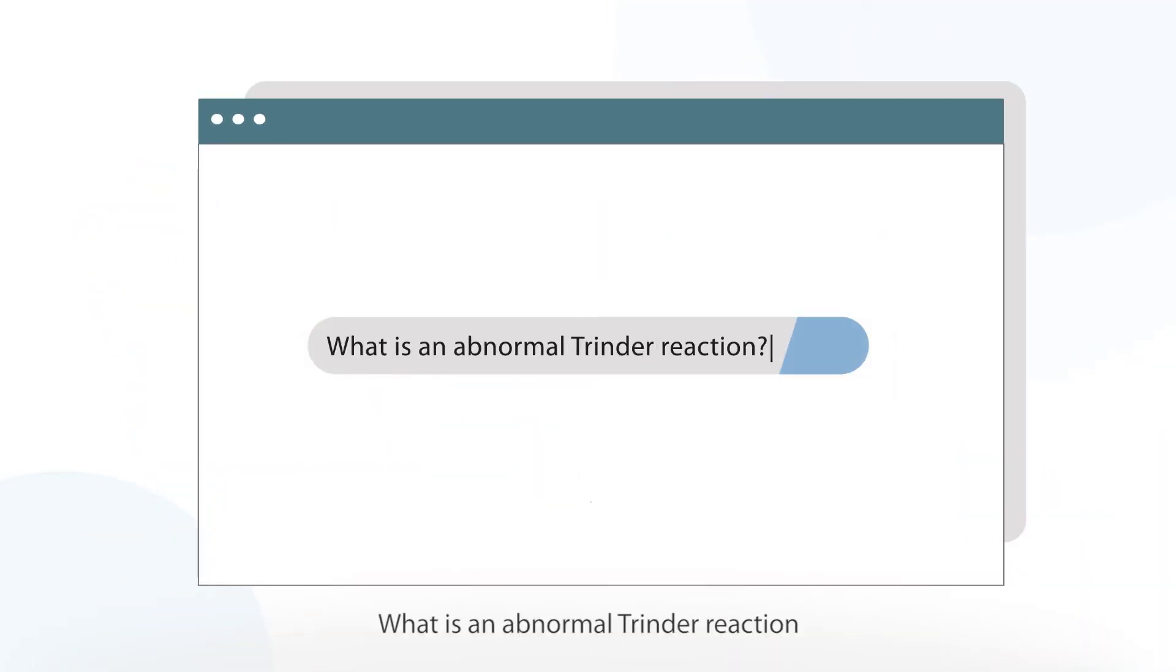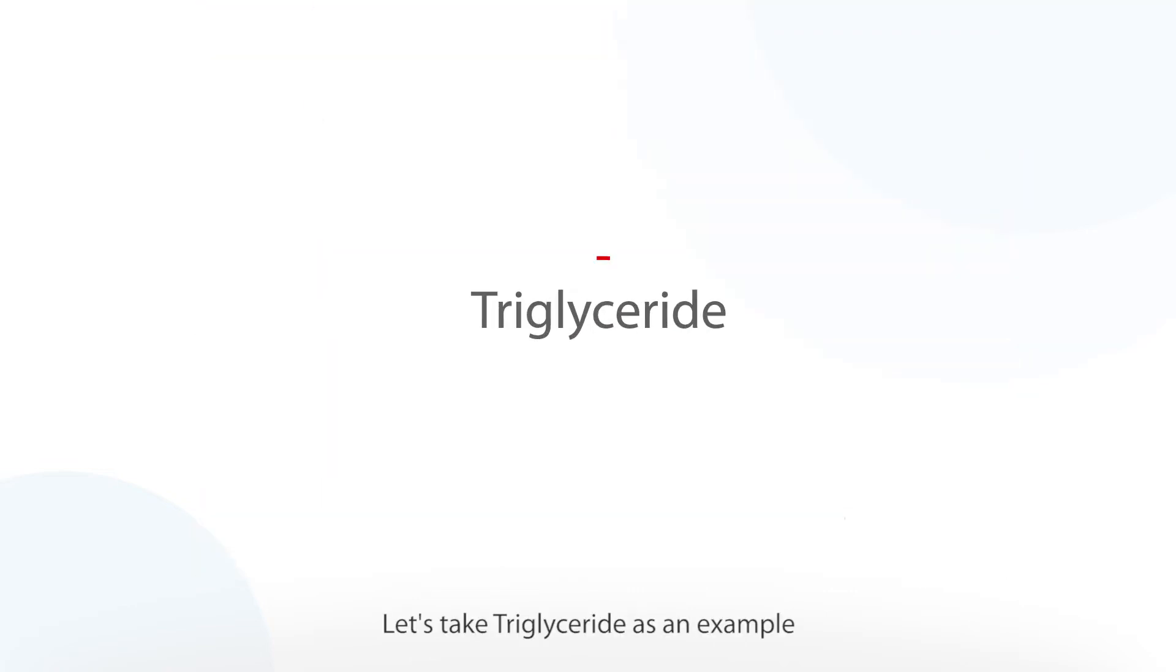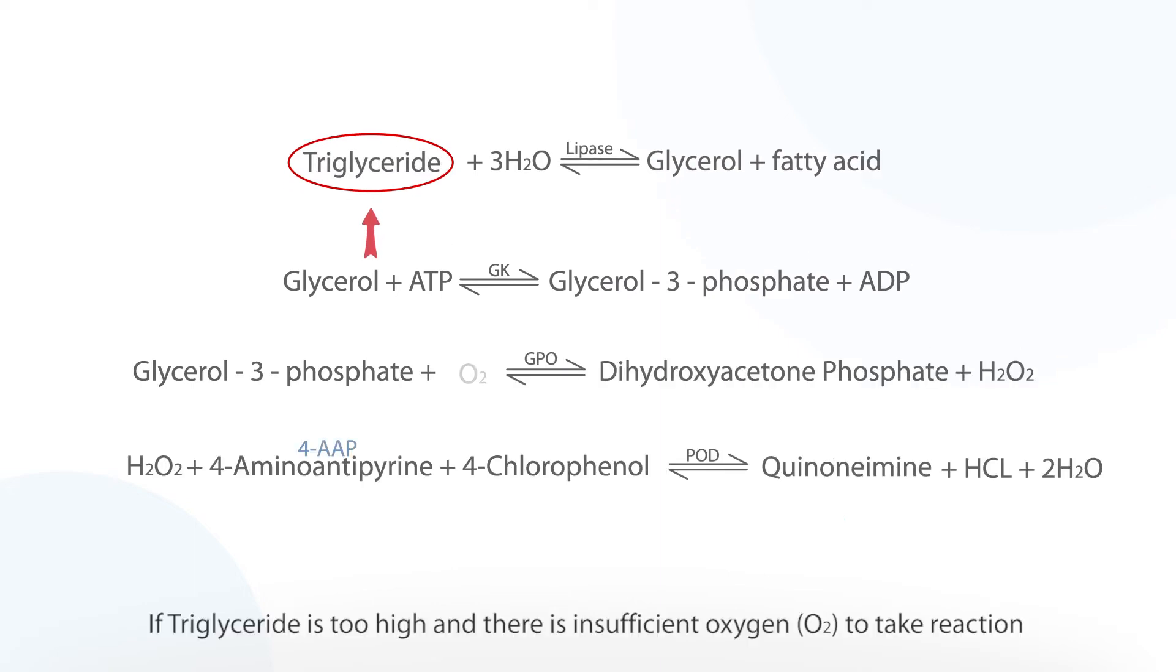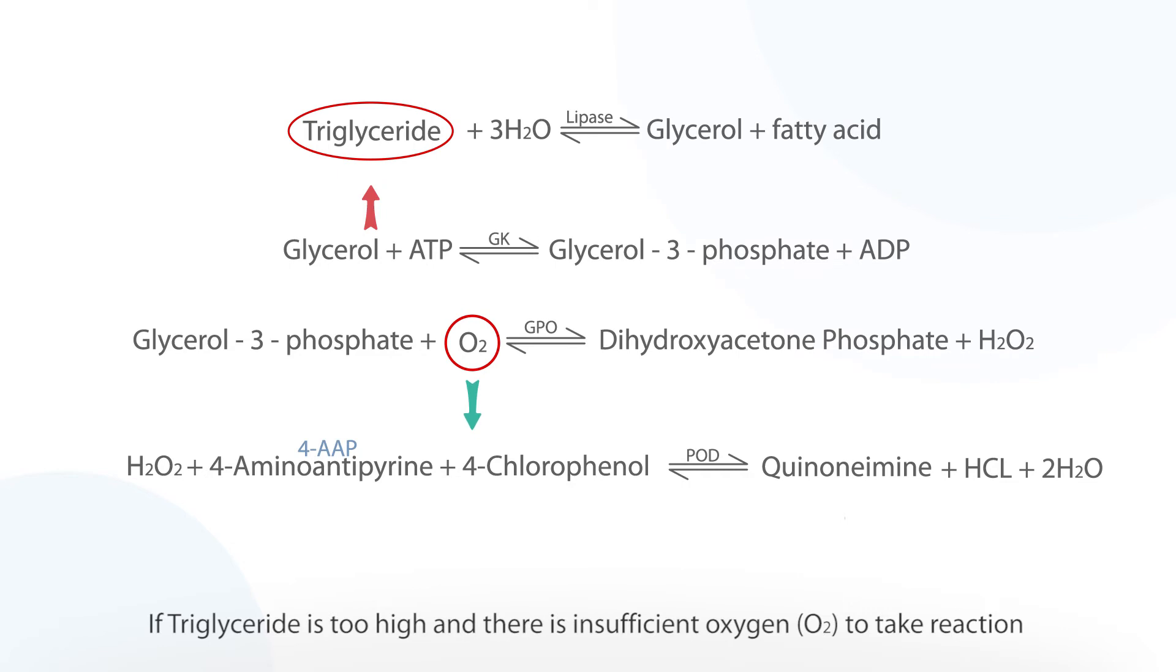What is an abnormal Trinder reaction? Let's take triglyceride as an example and look at its reaction process. If triglyceride is too high and there is insufficient oxygen to take reaction, the final product, quinoneimine, will first increase and then decrease.